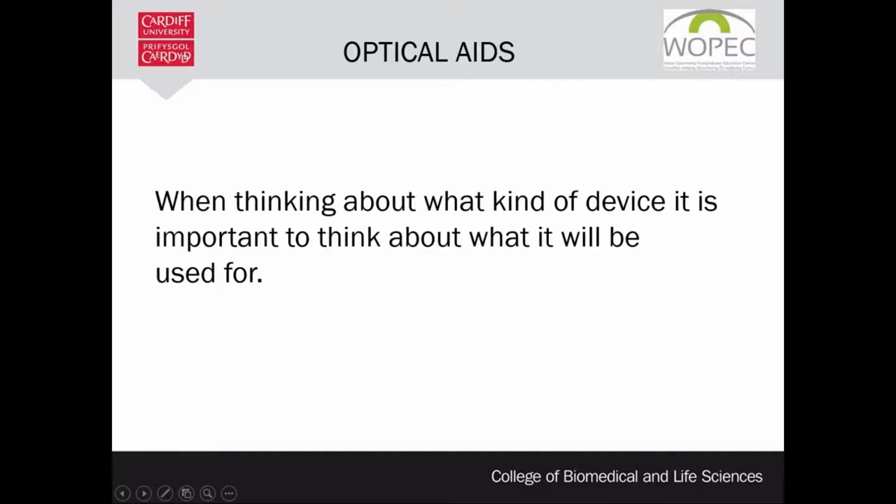You should also look at the client's medical condition. If a client has trembling fingers or arthritis, then you would have to take these into consideration when prescribing the magnifiers. Giving such client optical aid that needs long periods of handling will not be very beneficial. Let's go on to look at some advantages and disadvantages of some of the available devices.